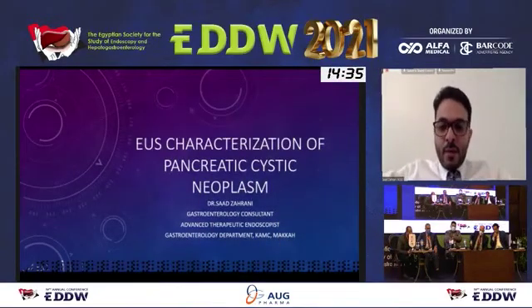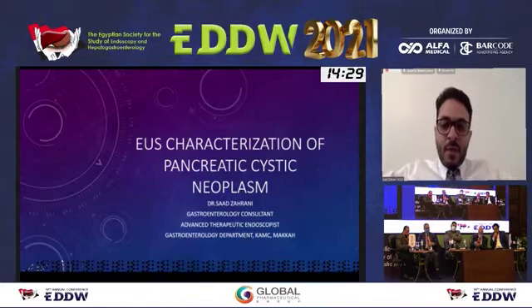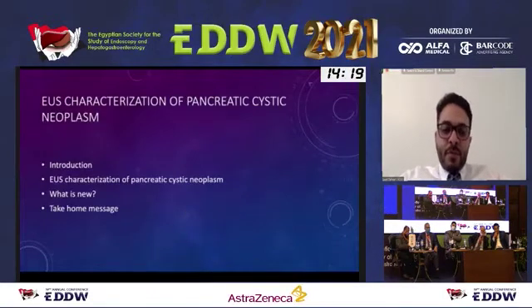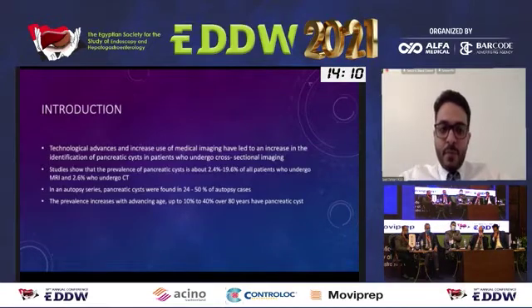Assalamu alaikum. First of all, I would like to thank you for inviting me to such an important scientific meeting, and it's my pleasure to be here. Today, I'm going to talk about endoscopic ultrasound characterization of pancreatic cystic neoplasm. I'm going to give a brief introduction, then talk about EUS characterization of pancreatic cystic neoplasm, what is new, then the take-home message.